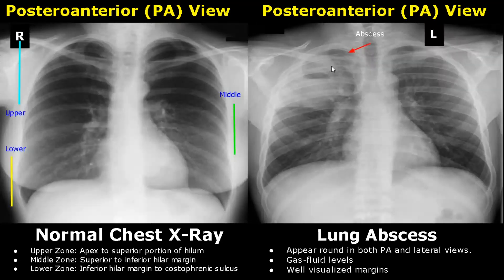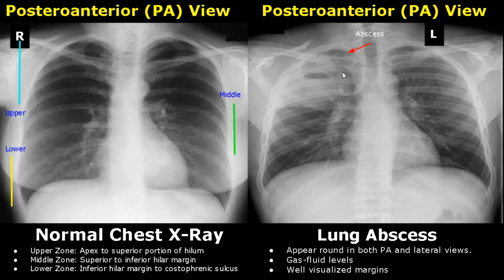A lung abscess will usually appear round in both PA and lateral views. It will have gas fluid levels — that means there is air on one side and fluid on the other side inside the abscess. The abscess will have well visualized margins.